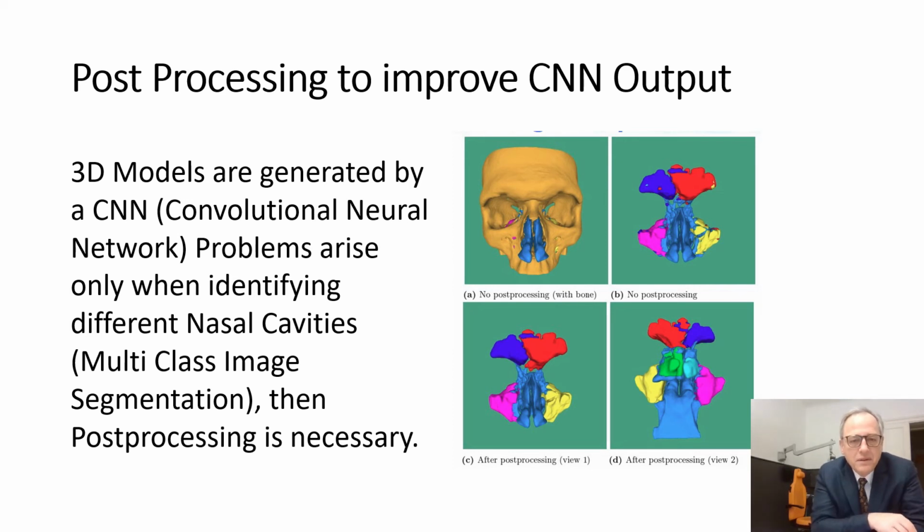Now to the post-processing to improve the CNN output. 3D models are generated by a convolutional neural network. Problems arise only when identifying different nasal cavities. For multi-class image segmentation, post-processing is necessary.